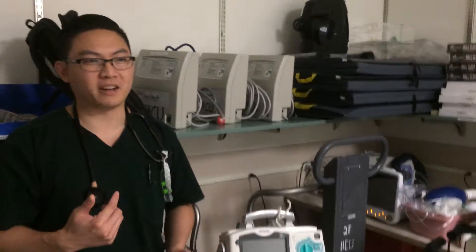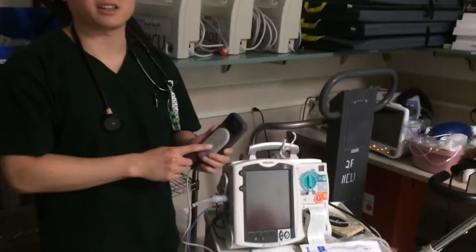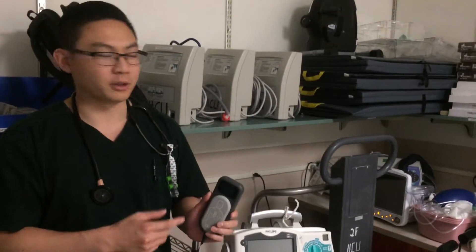My name is Brandon and I'm here to talk about using the puck, or the chest compression puck, for the Philips defibrillator.